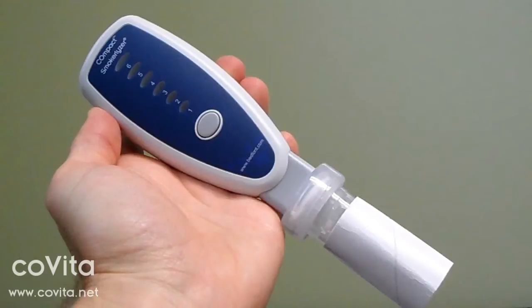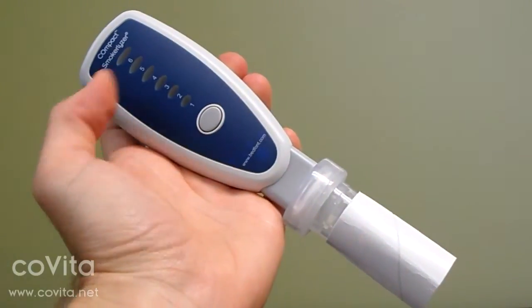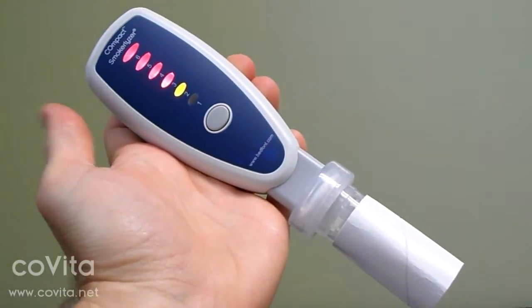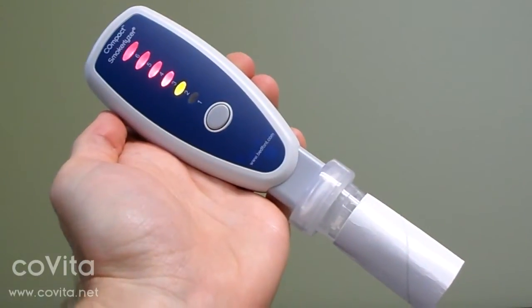To turn on the compact, simply press and release the button. The compact will immediately start a 15 second breath hold countdown. During the 15 second countdown, the patient should be holding their breath.